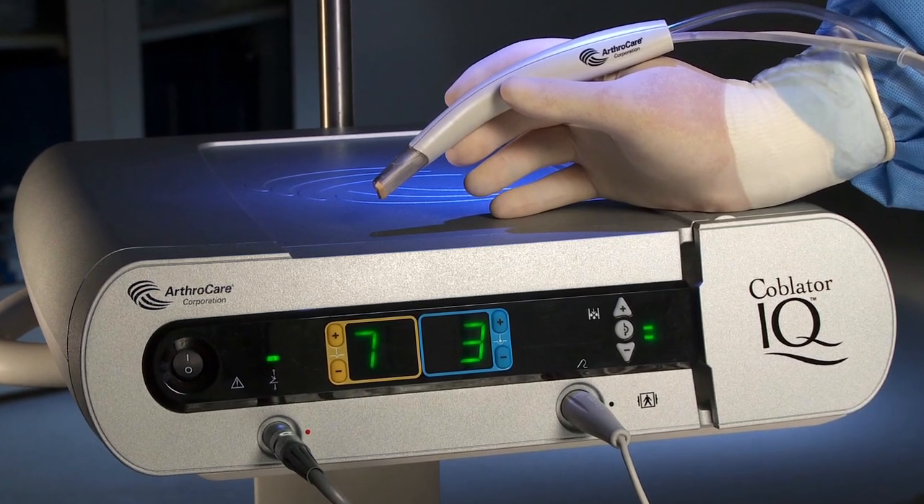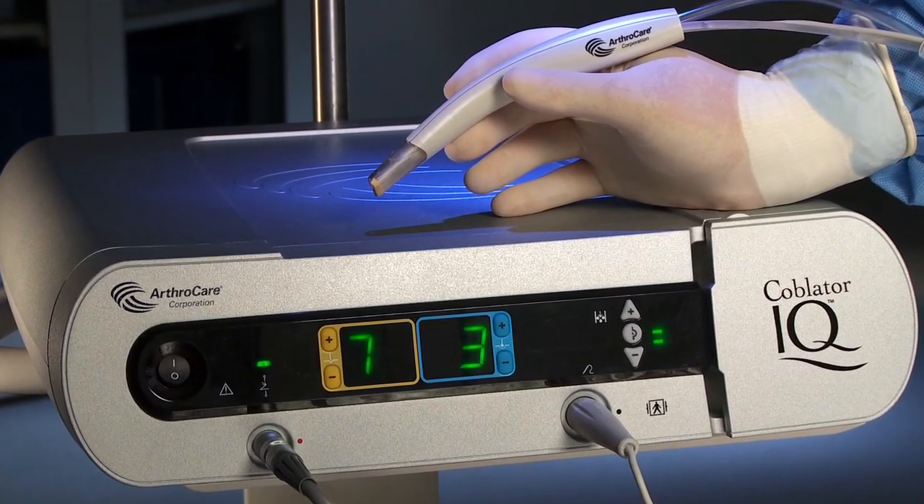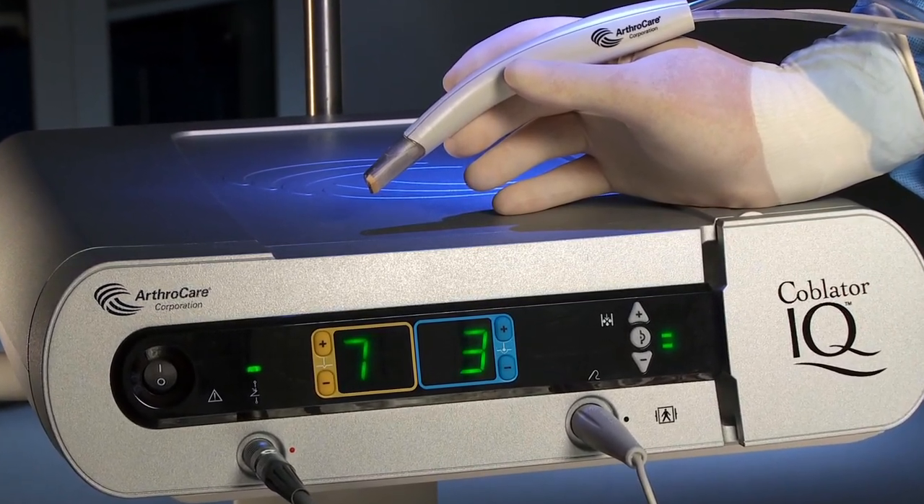The Wound Wand debridement device from ArthroCare. Experience the future of wound debridement.